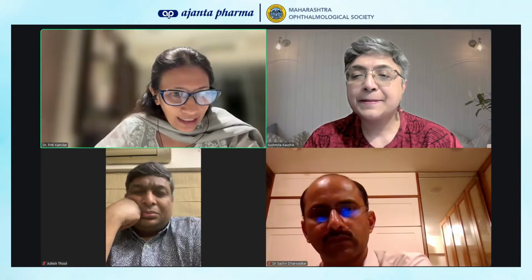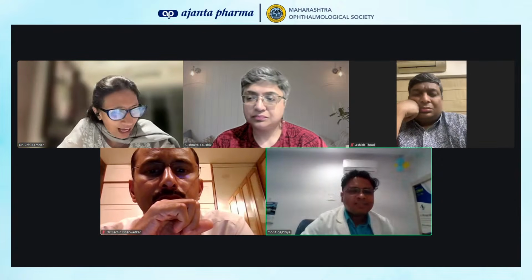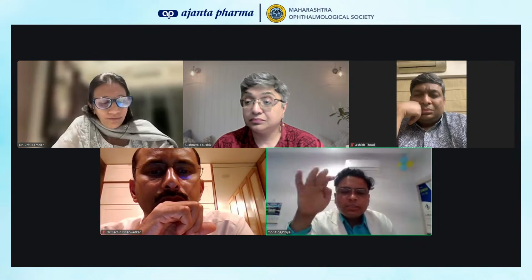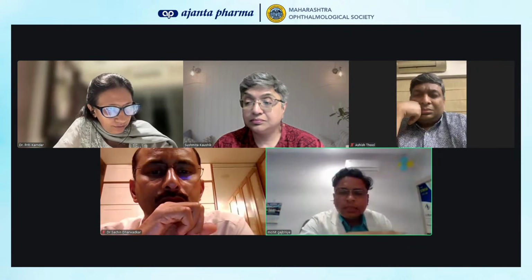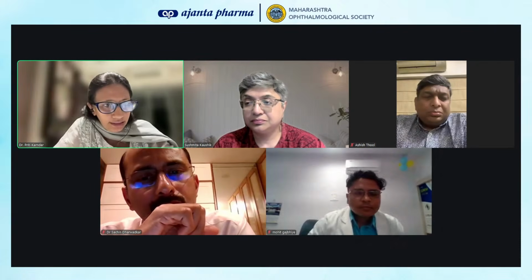And the next question I'll direct to Dr. Mohit. How frequently should OCT be repeated in diagnosed cases? Dr. Mohit, are you there? Yes. In the first 2 years, I would like to repeat the OCT or HVF at least 6 monthly. And once I find out that the disease is stable, or I find out the baseline, then I can repeat every 1 year. Okay, fair enough. So, Dr. Sachin, every 6 months?